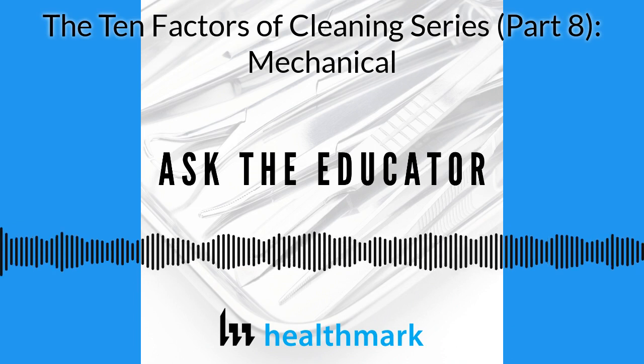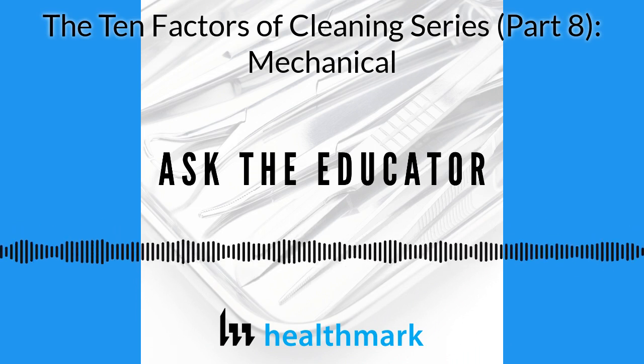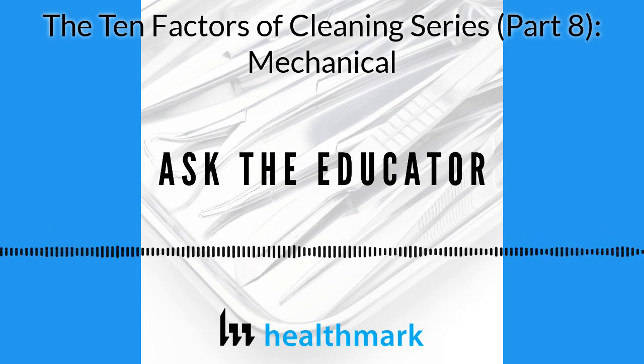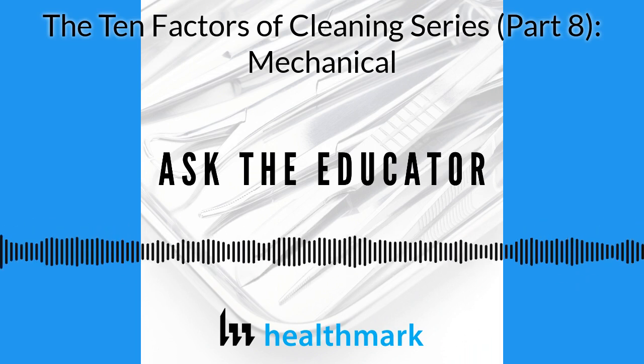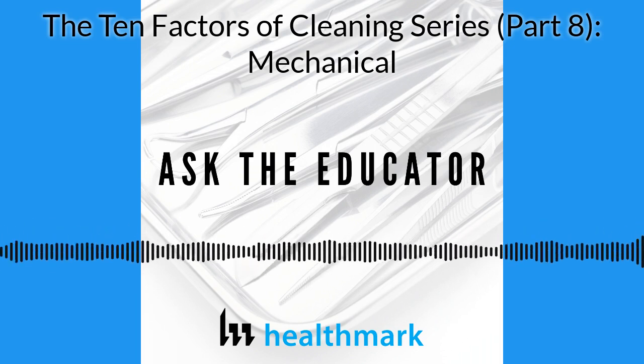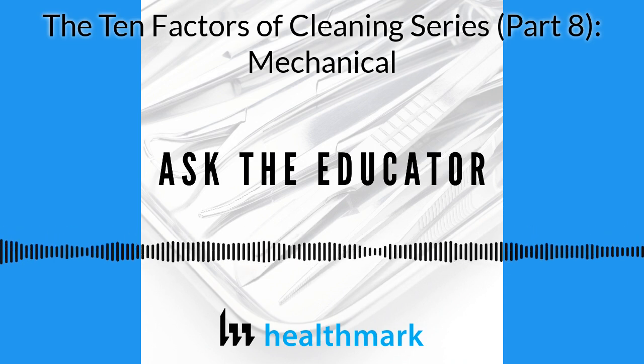That's a real good point, Kevin. I didn't mean to interrupt you there, but if you have a multifunction sonic, that lumen part might not work, but if you know your sonic is still working with cavitation and can clean your regular instruments, you can still use that. You just don't do the others. So if you really know your equipment and how it's working, part of it could be shut down, but you can use the other. I think that's the point you're trying to get our listeners to understand: what is it you're testing for?